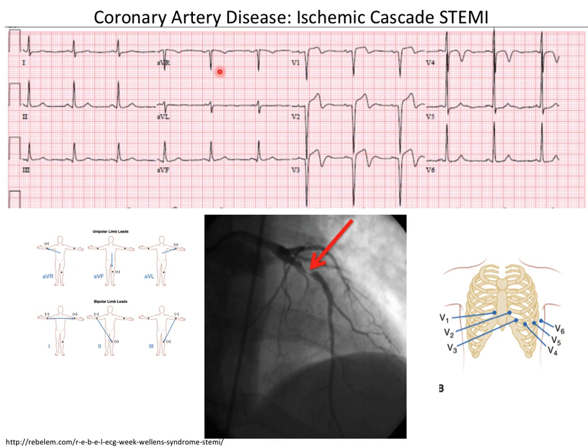So here's somebody who presents at the cath lab. They take the EKG. You can see these look kind of normal. However, we have this huge ST elevation right here on V1, V2, V3, all of these across here. We have this big ST elevation, and that's an indication that there is some kind of myocardial infarction in there. This person goes straight to the cath lab.